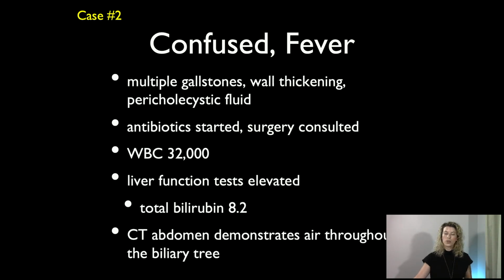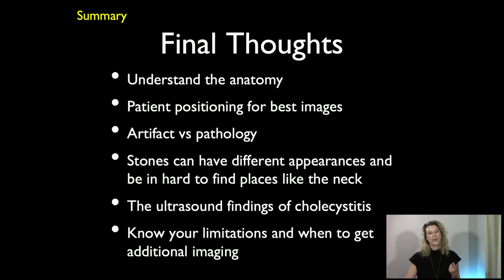Right, so she has acute cholecystitis, antibiotics are started, surgery is consulted, all of the things fit. She's got a leukocytosis, liver function enzymes are elevated, and because she was so sick, a CT scan was done and shows some real significant pathology that shows maybe it perforated. So you did her a service by doing a bedside ultrasound, which started her treatment really early and got expert consultation on board really early on in her course. So you did a lot for this patient by doing point of care ultrasound.